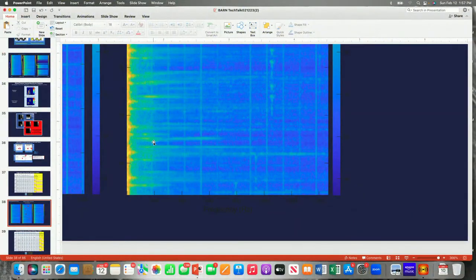And as the blood rushes over that, it makes a shh sound that's indistinguishable if you only look at the frequency, if you only look at this level. And of course, it occurs during the diastolic interval when the heart is refilling, when the ventricle is refilling.